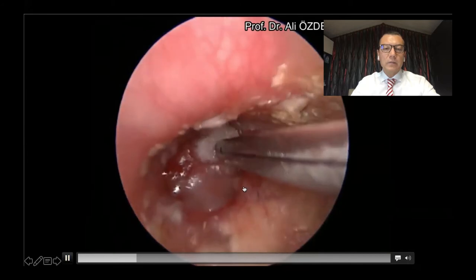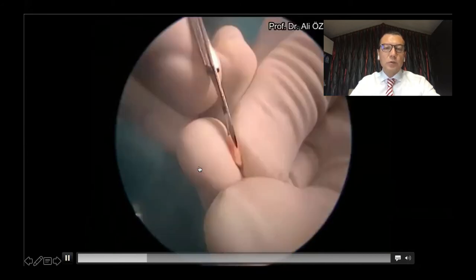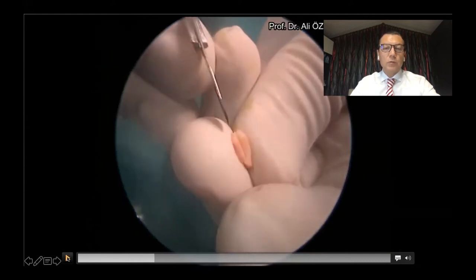And then we put some absorbable gel foam into the middle ear through the perforation. After that, we take a piece of cartilage from the tragus.